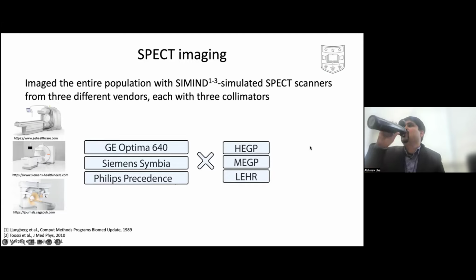Exactly, and that is the goal. Even in that case, is our method reproducible or not? If I have a different collimator that may not be ideal for that setting, but someone uses that collimator, how reproducible is our method going to be in that setting?